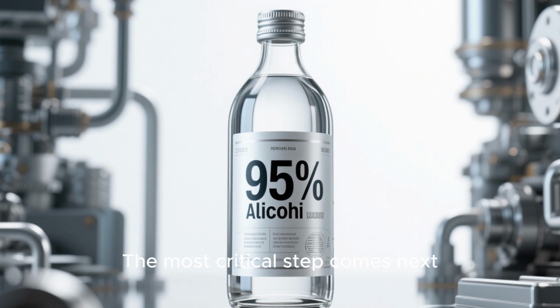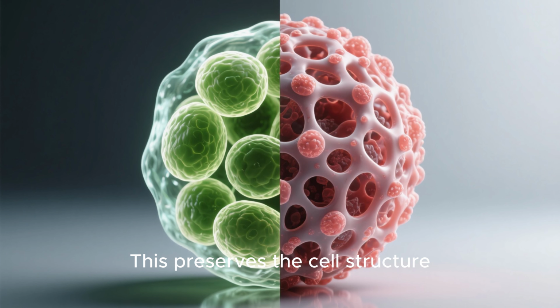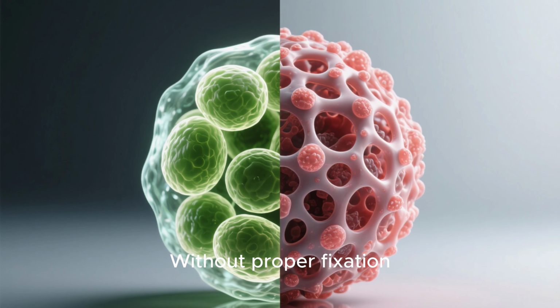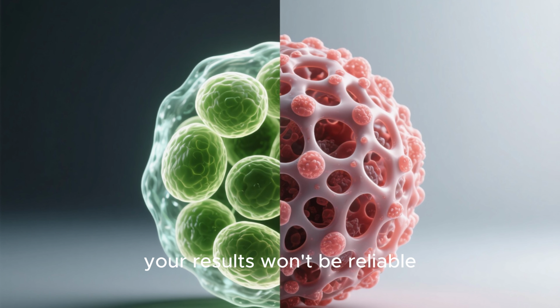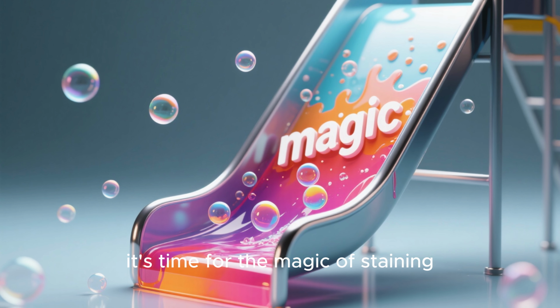The most critical step comes next. You must immediately fix the sample with the alcohol. This preserves the cell structure and prevents them from drying out or distorting. Without proper fixation, your results won't be reliable. Once the sample is collected and fixed, it's time for the magic of staining.